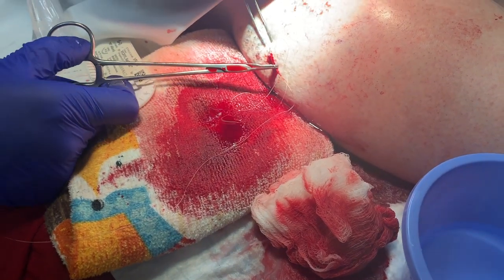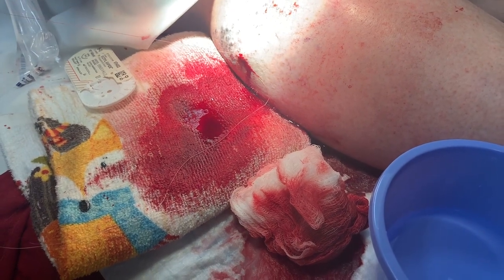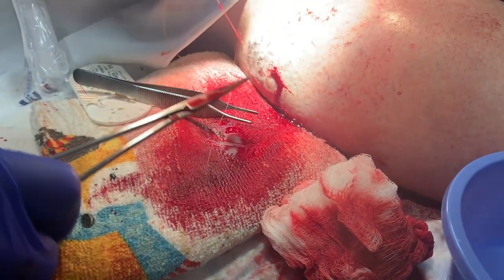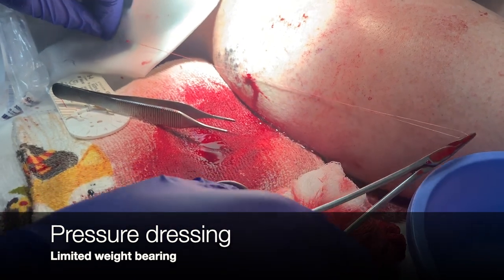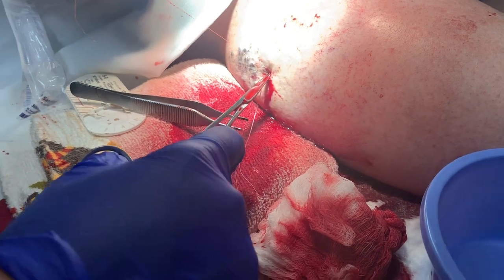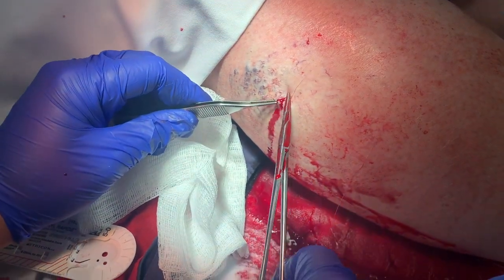You okay? I'm good. Are you feeling much pain? No. Good. Hopefully you're nice and numb there. I'm just going to tie this off again. And that should about do it. What's most important is that we get a pressure bandage on this patient and have her sit and do nothing today, because otherwise it's going to start bleeding again.